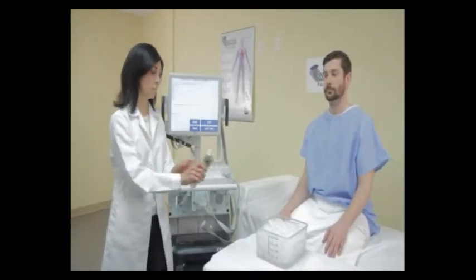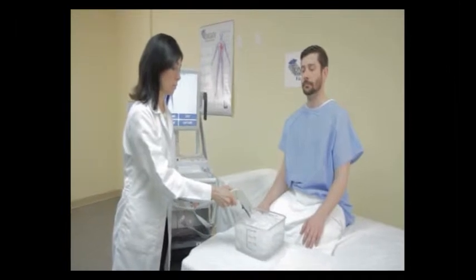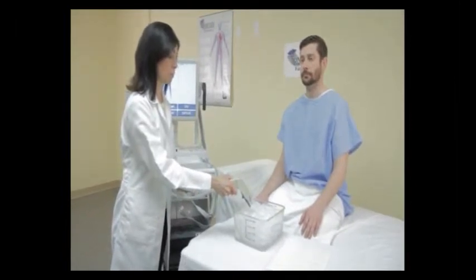Make sure you use your gun to check the temperature of that water. It should be right around 40 degrees before you begin your examination.